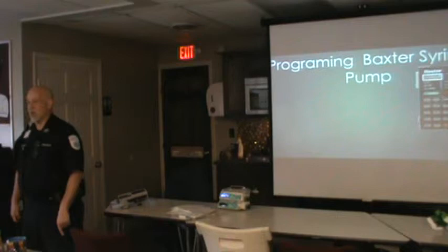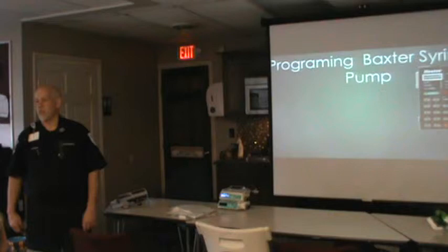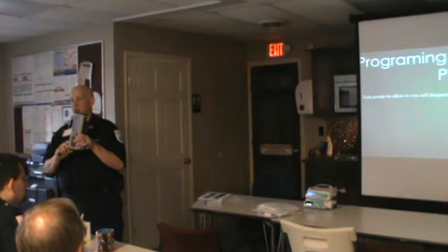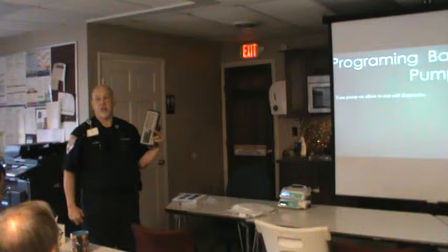The last page of the handout is the keypad on the Baxter syringe pump. Turn the pump on — the switch on the Baxter pump is on the left-hand side. You just turn it on, it's going to play some music, come up with a bunch of numbers, and then you're going to think the battery's dead. If you just wait a second, it's running its self-check.